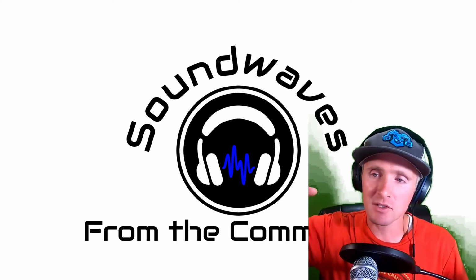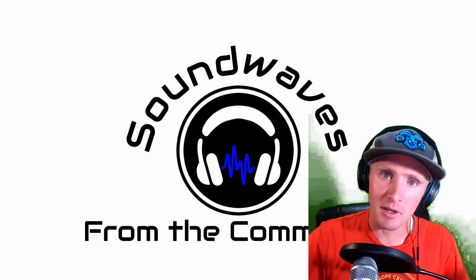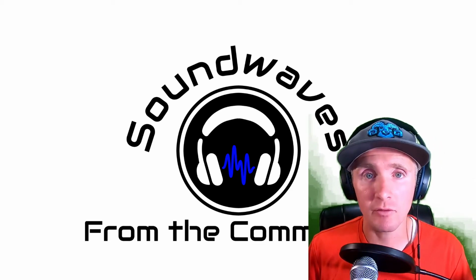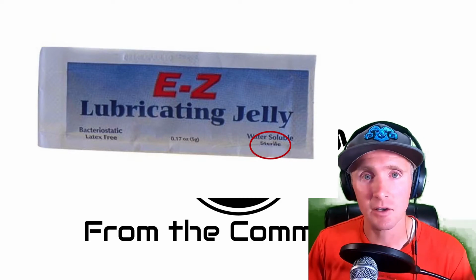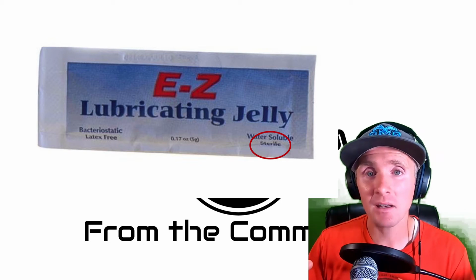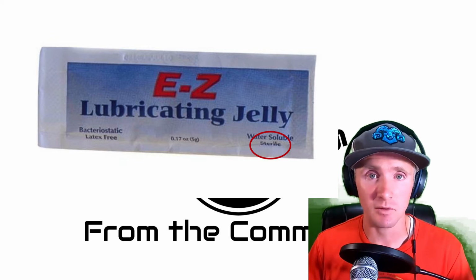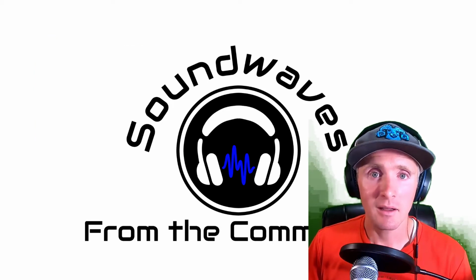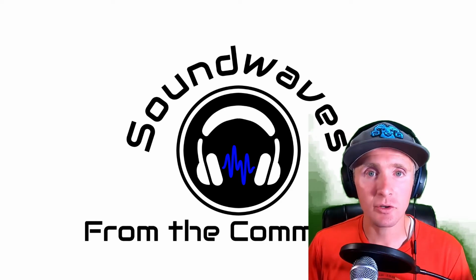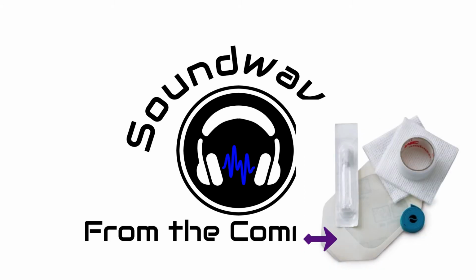Because if you're going at a fairly steep angle, or even more so if you're going shallow and the arm is bent, you're going to have a hard time getting the angle that you need to get into your access. And you want to use sterile gel for this. If you just get the sterile Surgilube packets that you use for rectal exams, the gel's sterile out of the packet, so you can use that. You don't have to have the more expensive kits with the sterile probe cover and the sterile gel that comes in them. You can just use the sterile Surgilube packets. I would put something over the end of the probe though, and there's been a debate about this.